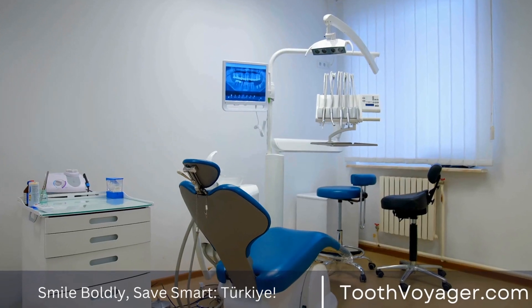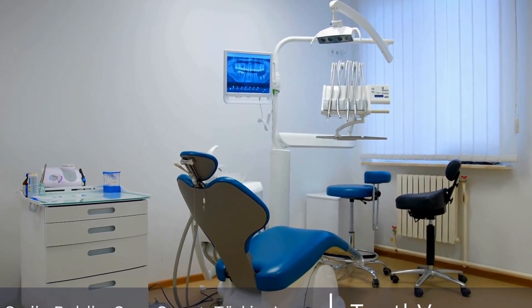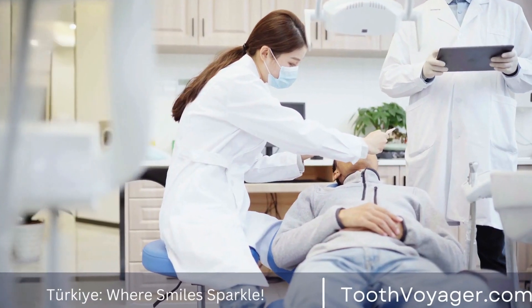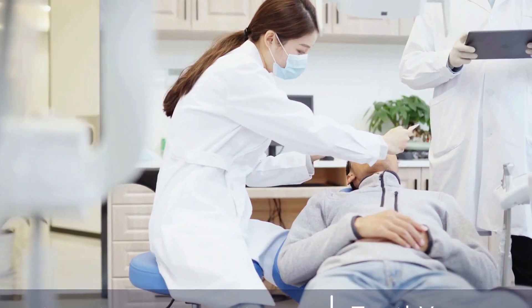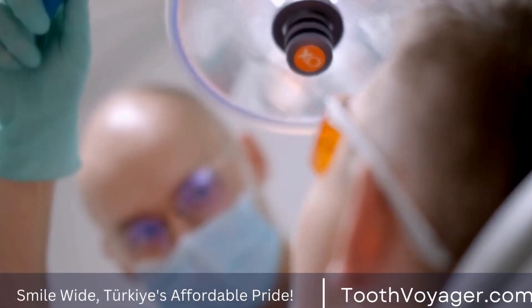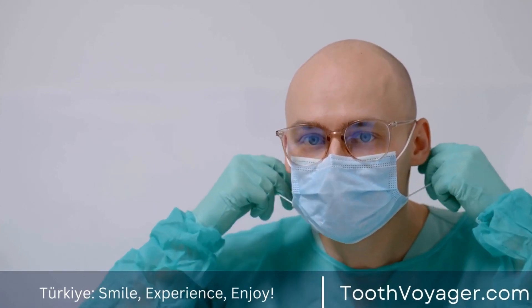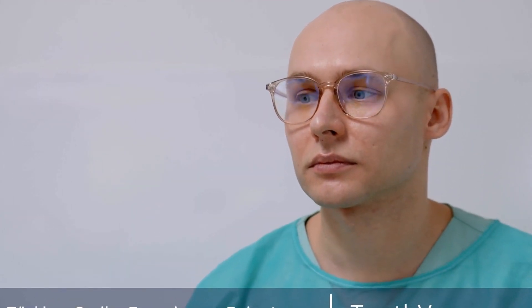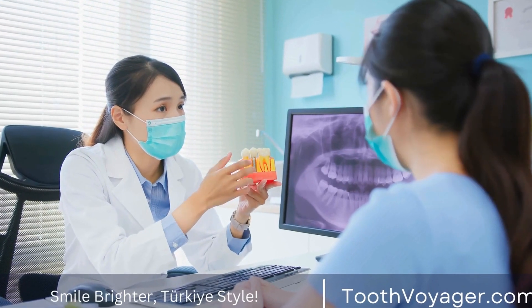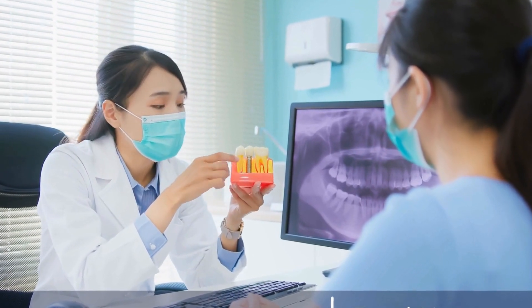After the final restoration is placed, your dentist will ensure that it fits properly and feels comfortable in your mouth. They will also provide instructions on how to care for your new restoration and maintain good oral hygiene to prolong its lifespan. Implant dentistry offers a permanent and stable solution for replacing missing teeth. By following your dentist's recommendations and practicing good oral hygiene, you can enjoy the benefits of dental implants for many years to come.